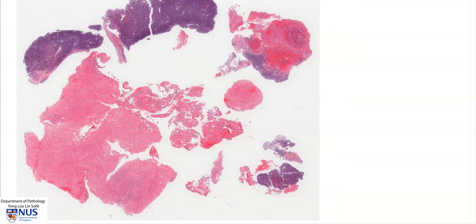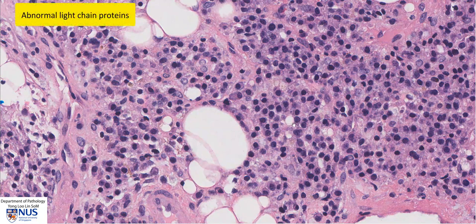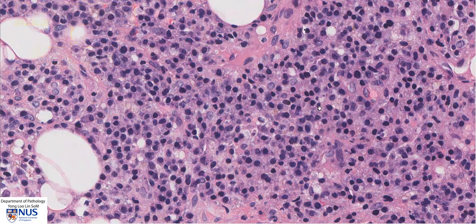Moving to another area which is a little bit thinner, we can perhaps appreciate the plasma cell morphology a little bit better in this instance. Plasma cell neoplasms can produce abnormal light-chain proteins, and in some instances this can give rise to amyloid deposition, which is an insoluble extracellular protein. In some cases of multiple myeloma, some of these patients may have organ damage due to amyloidosis.